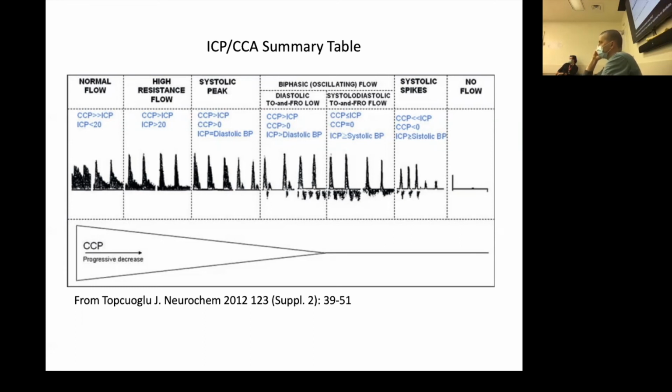Yes. Great. So can you differentiate between an intracardiac and an intrapulmonary shunt on TCD? When you're doing a TTE or transesophageal, we differentiate based on the beats at which we see bubbles on the other side. Is there a way to differentiate that? That is a great question, Timothy. I don't truthfully know the answer. I don't think you really can. You're so distal. I've never read of a technique where that's been done.